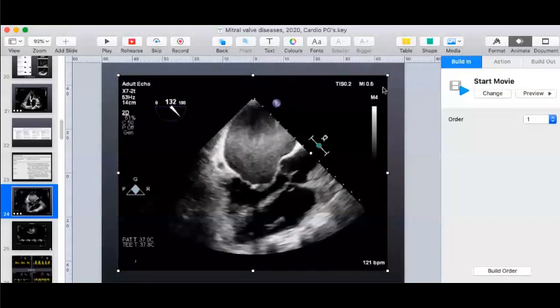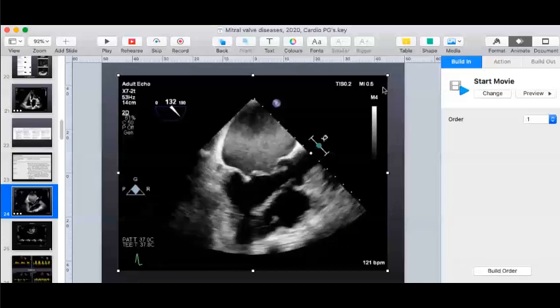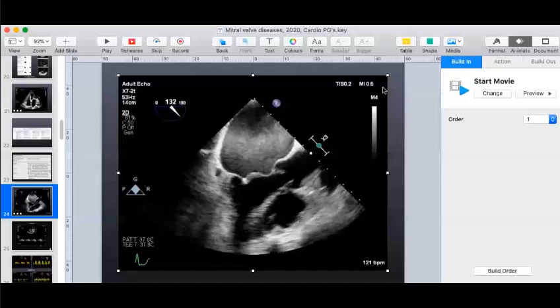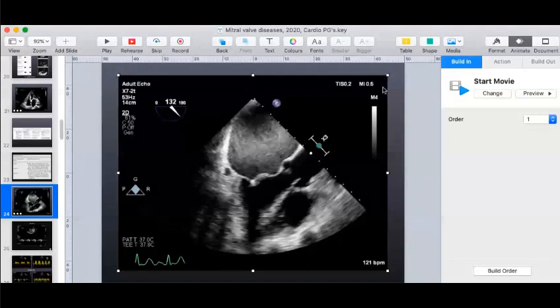Okay, a slight modification to that. 0, you are correct. Grade 1 SEC is where you see intermittent SEC, right? You don't see it continuously. You see it on and off. That is the first point. Second point is that to see this SEC, you have to do some noise adjustments. You have to increase the gain. So when you do this and you see SEC, it is called grade 1.